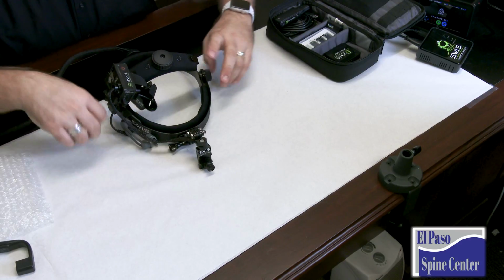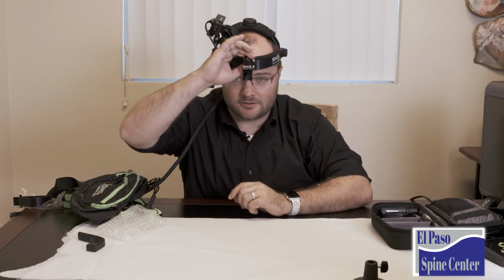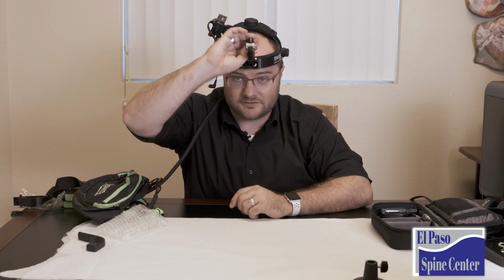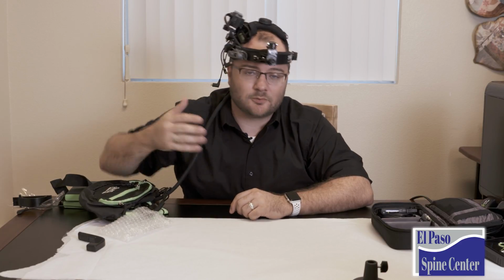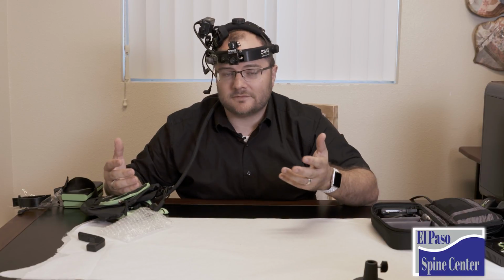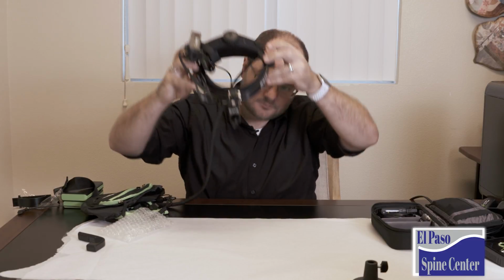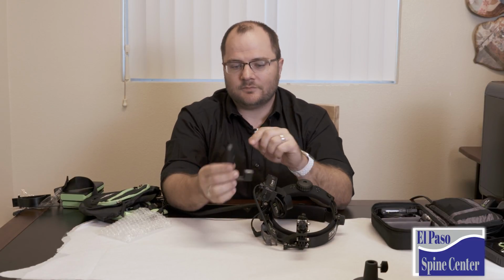And then what that lets you do, what that will look like at this point, is you have your headgear up, and you can actually articulate that sensor wherever you want. It can be pointed up, down, wherever it needs to be for the operator to be most comfortable and to see what they're going to see. So then that brings up the question of how do you actually see what the GoPro is going to see? Well, that's where this viewfinder comes in.